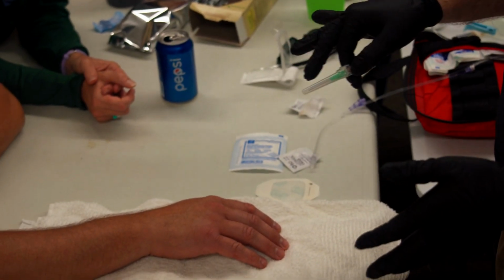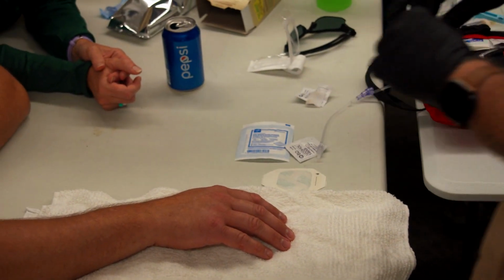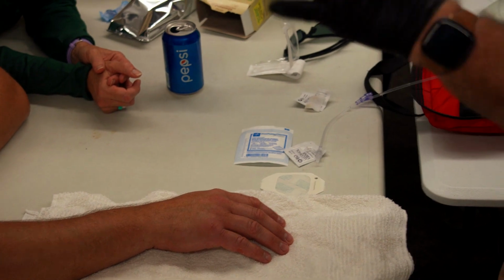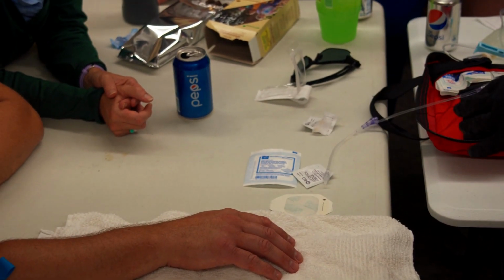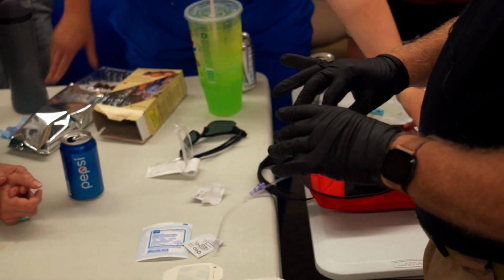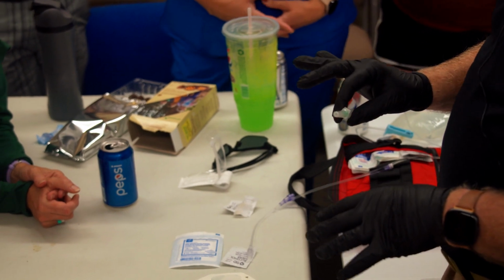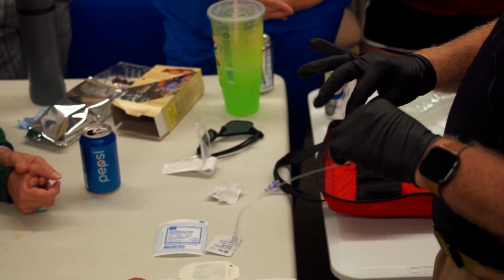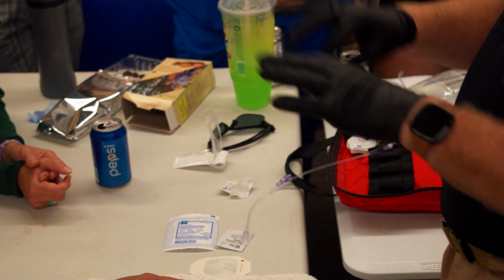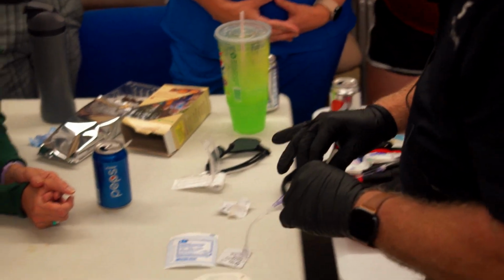Once you have a sharps out and about, especially if it's been put in anybody, we don't want a needle stick with somebody else's blood on it. So once that's there, everybody else needs to stay out of the way. If we're handling needles, it goes into a sharps container once you're done with it. This one is going to be retracted, and we'll play with that a little bit. The other thing is to not recap needles. Once you've opened them, you don't want to recap, because you run that risk.